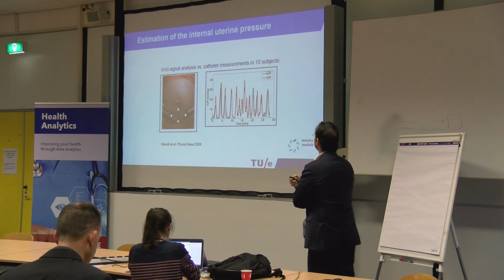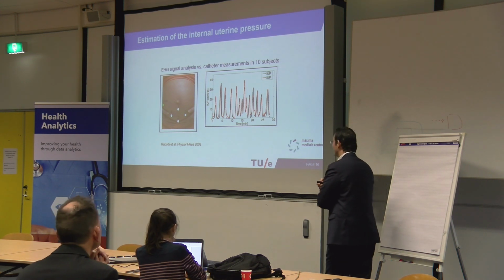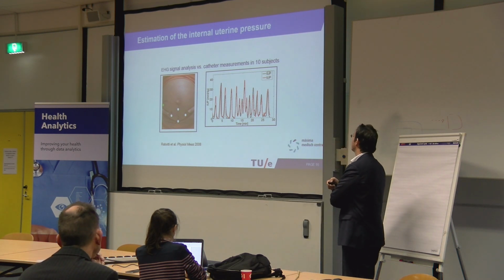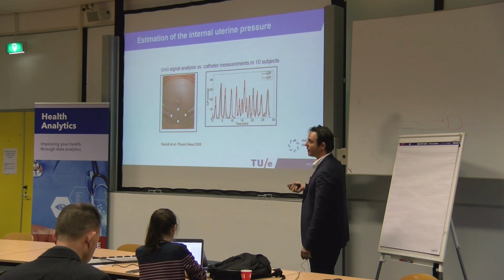So this is in fact evidence that indeed the use of electrical potential is a quite promising approach in order to measure intrauterine pressure and therefore uterine contractions in general. And this was, of course, during labor.